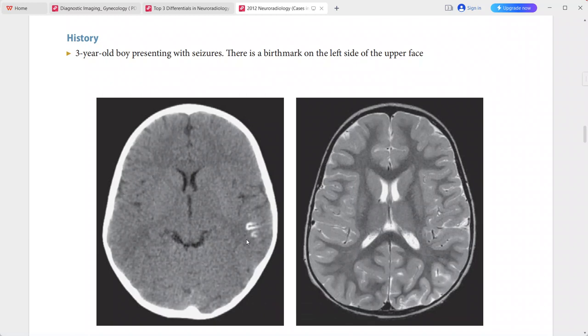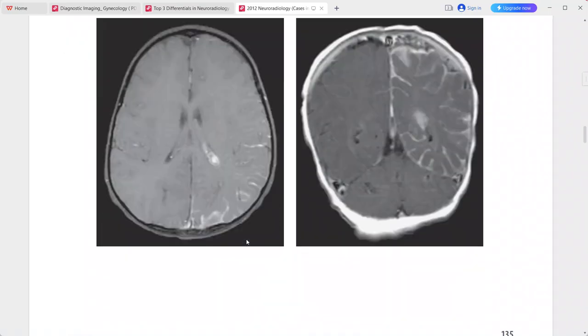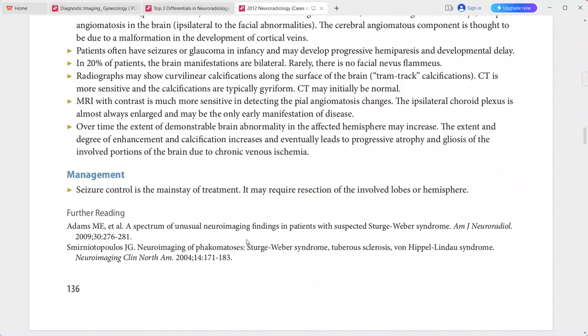These imaging descriptions are typical for Sturge-Weber syndrome (encephalotrigeminal angiomatosis). Differentials include meningitis, leptomeningeal metastasis, other vascular malformations, and subacute infarcts with enhancement.